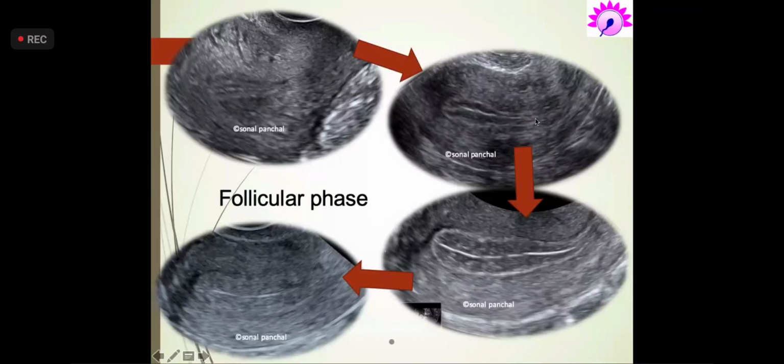When there are either multiple follicles or the cumulative estrogen is high, as in PCO patients, that's when you get grade A endometrium. So if it's not a PCO patient, you usually expect a grade A endometrium when there are 3-4 mature follicles, as it occurs in ovulation induction cycles with gonadotrophins. So it's a multilayered endometrium with echogenicities in between, which is a grade A endometrium.